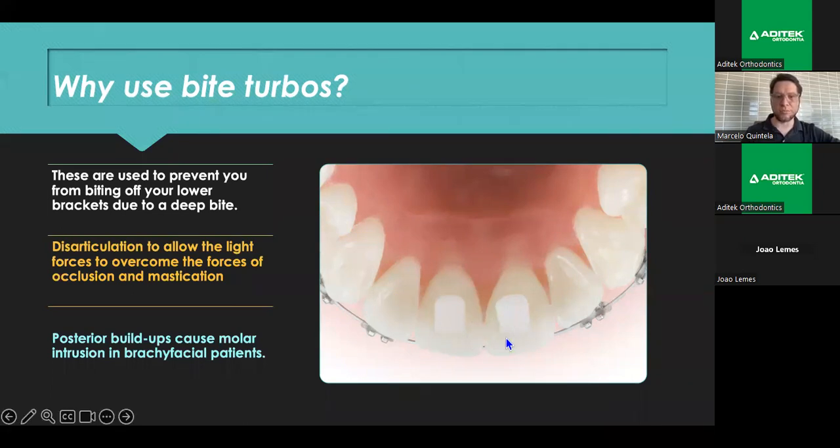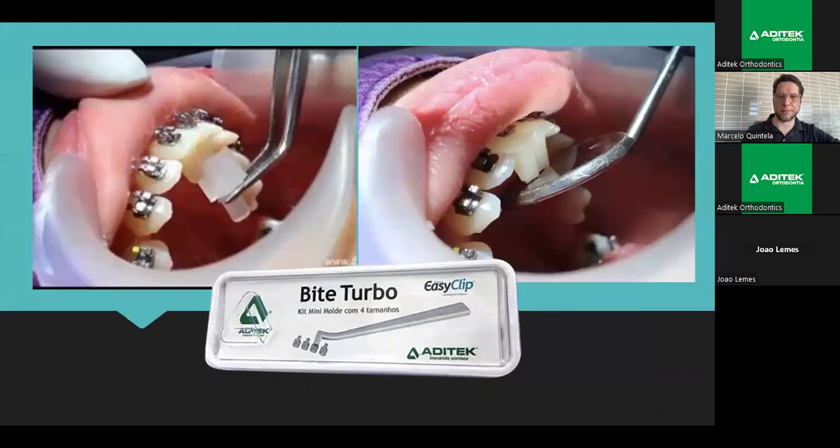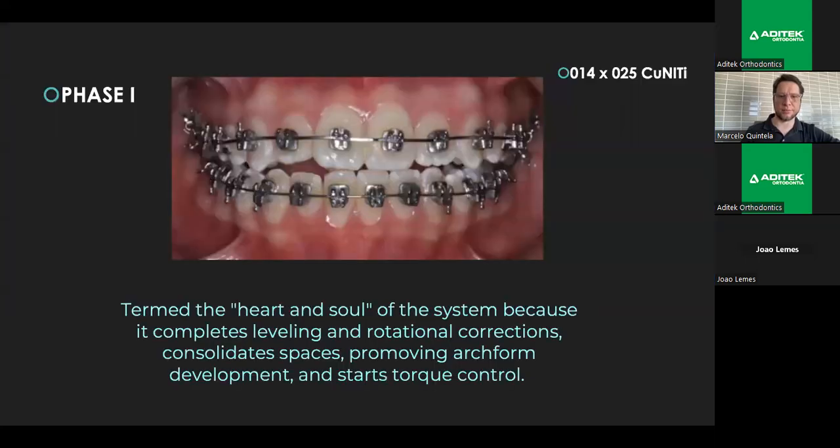Well, and posterior buildups cause molar intrusion in brachyfacial patients. So in brachyfacial patients, you always use biturbos. In dolichofacial patients, you can use them on molars. The installation is easy, so easy.